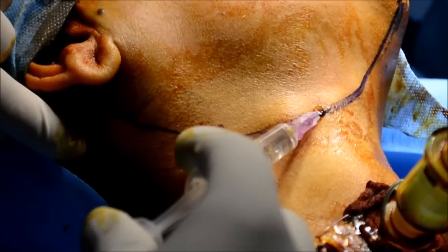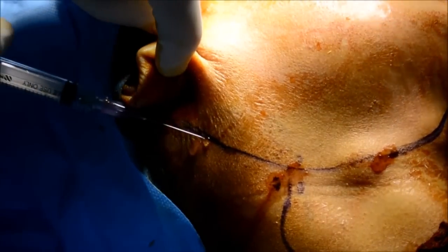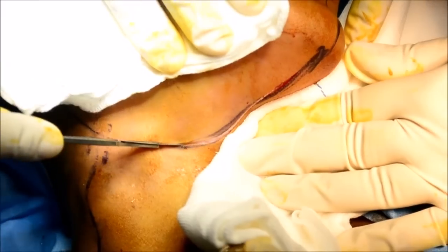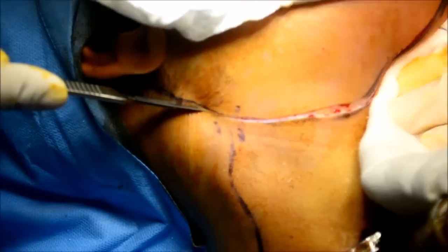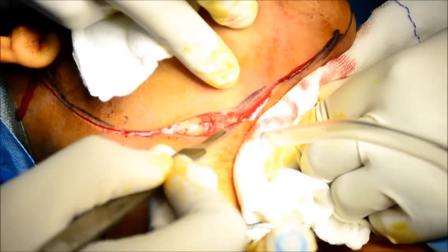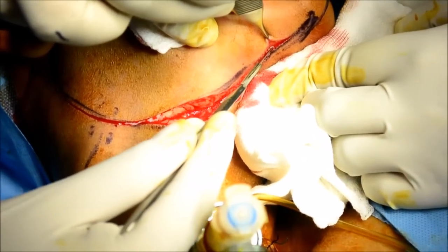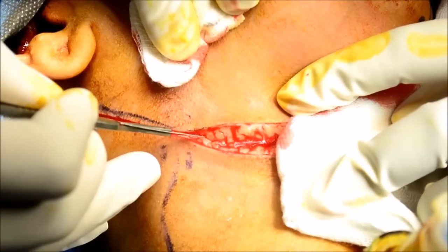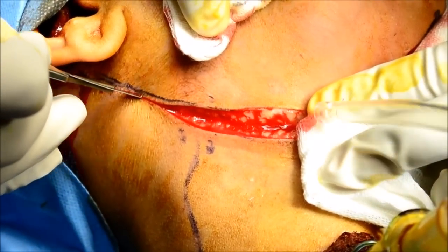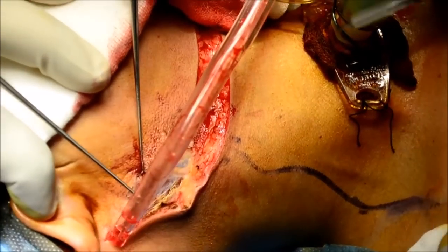We'll start with the modified Schobinger's incision by infiltrating the skin flap and then putting the incision. The incision is deepened until the level of the platysma. The trifurcation point should have 90-degree angulations, otherwise there is a possibility of flap necrosis.